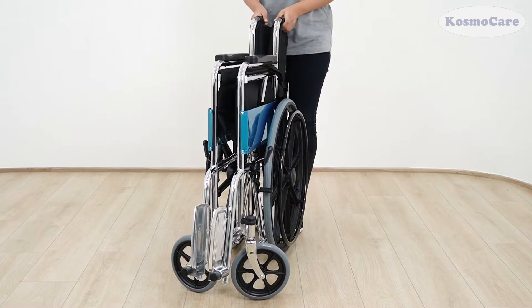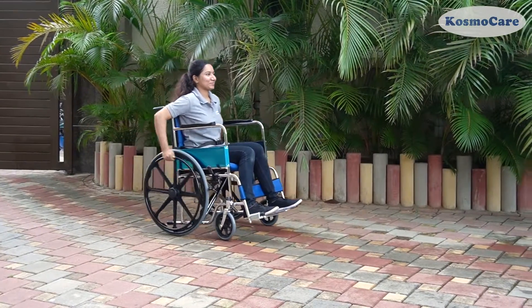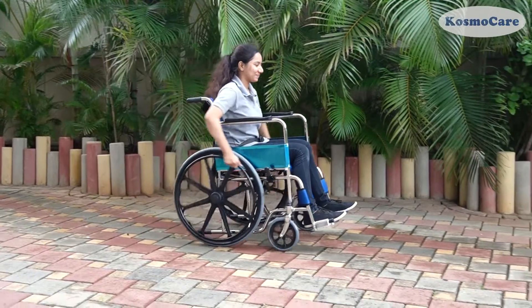Give your loved ones the convenience and freedom they deserve with the Dura Mag wheelchair with soft cushion from CosmoCare.